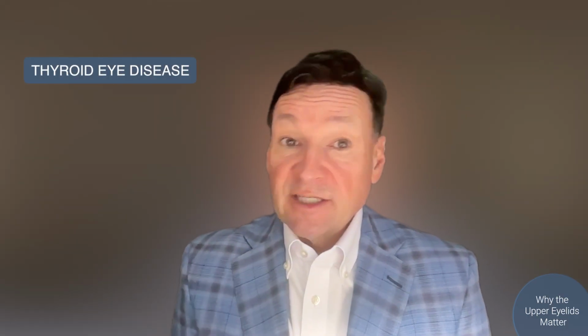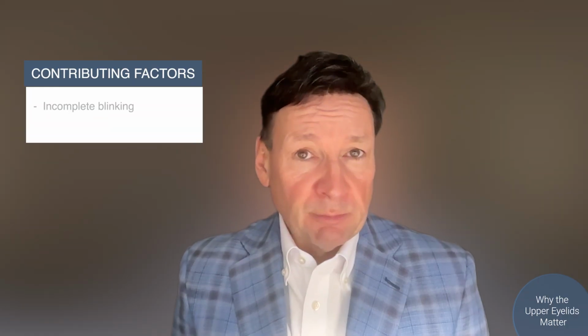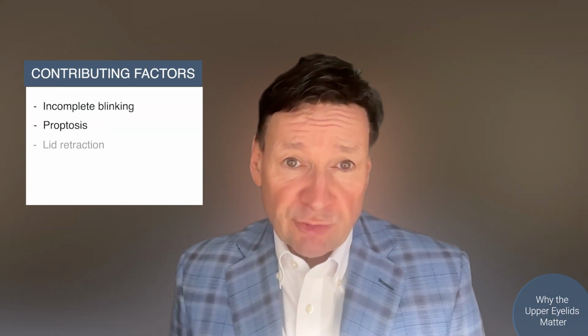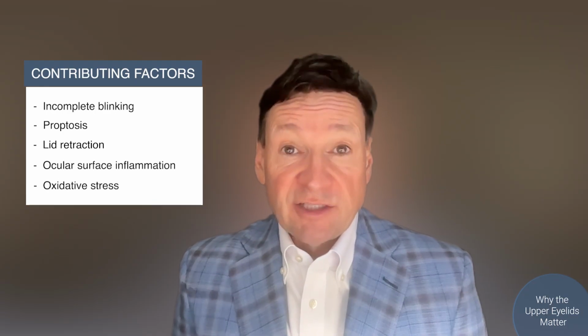Finally, let's touch on thyroid eye disease, where the upper lid once again tells a critical part of the story. Thyroid eye disease is another condition where upper eyelid meibomian gland status provides valuable clues. Patients with thyroid eye disease often show significantly higher upper lid meibo scores and central gland dropout compared to other dry eye cohorts. These changes are influenced by factors such as incomplete blinking, proptosis, and lid retraction, and they correlate with ocular surface inflammation and oxidative stress.